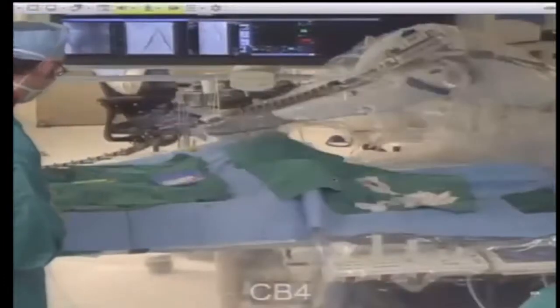What you're looking at right now is the femoral artery, which is the artery in the groin on the left side.